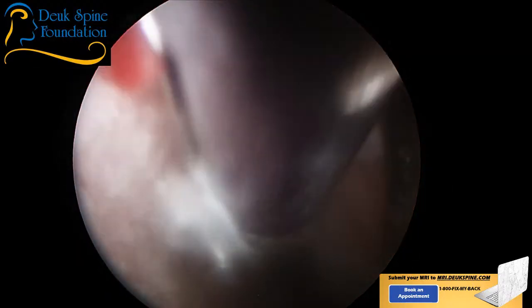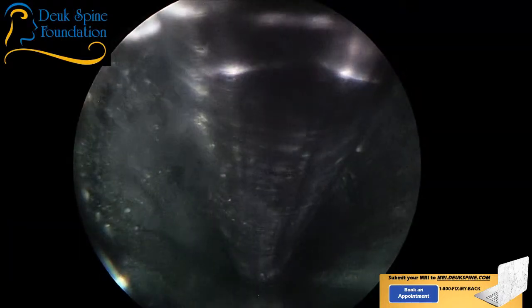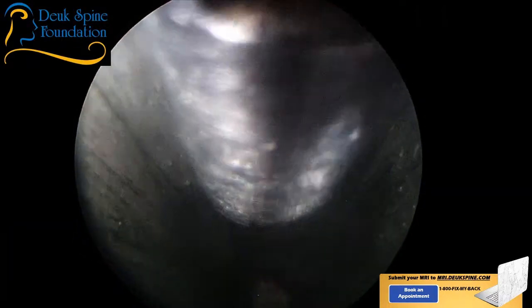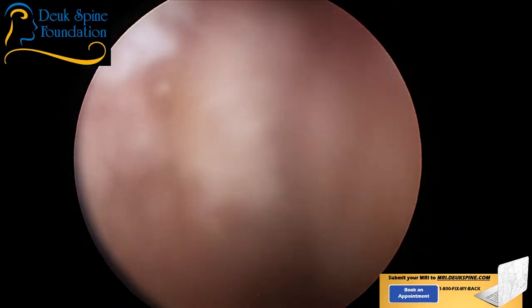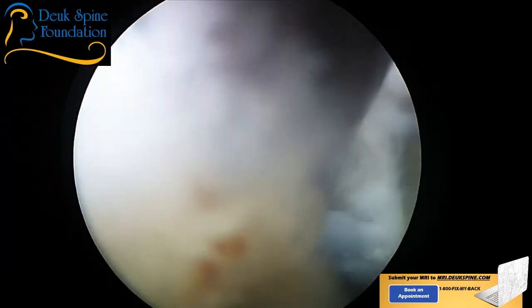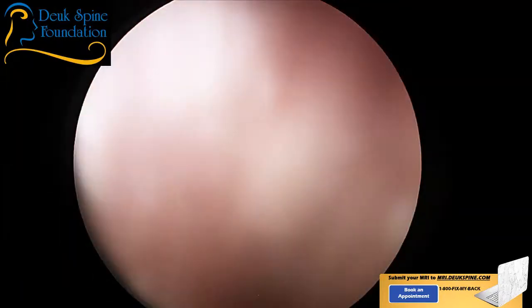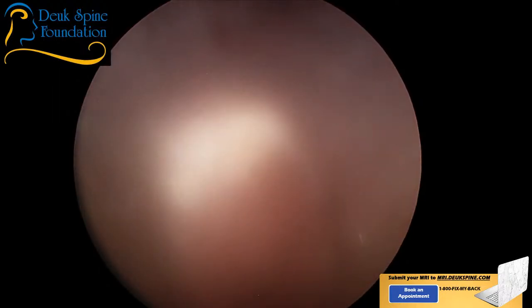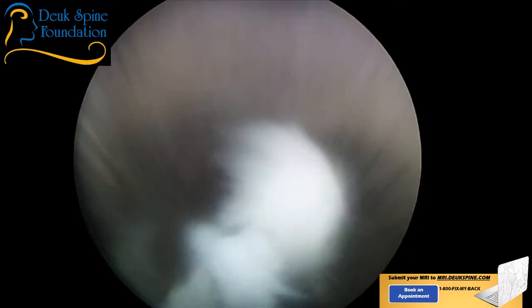But just going back to what we were saying, I need the patient to be comfortable, not feeling or responding to the pain. And I can't give them muscle relaxers because we need them to breathe. Giving a patient muscle relaxation like you see with general surgery, they would basically die from asphyxia, not breathing, because we've paralyzed their skeletal muscles. So we don't do that. We just need to work with technique and level of sedation rather than muscle relaxation, because I need them breathing.